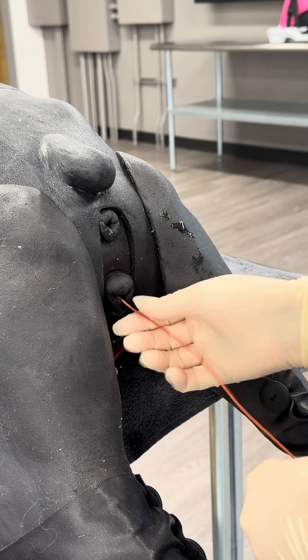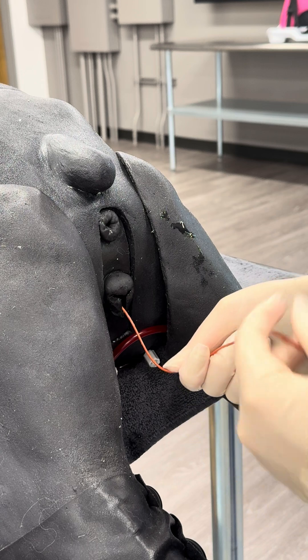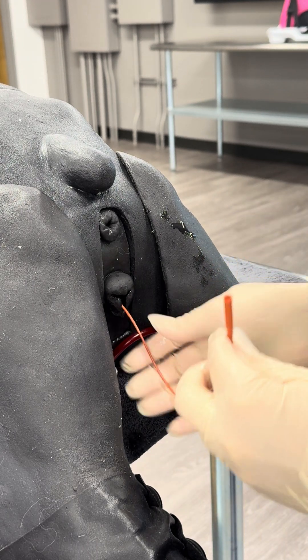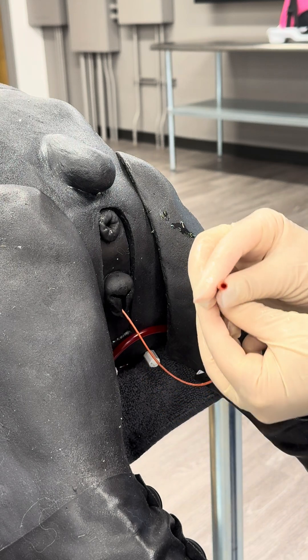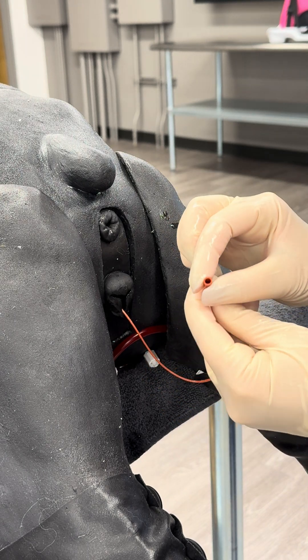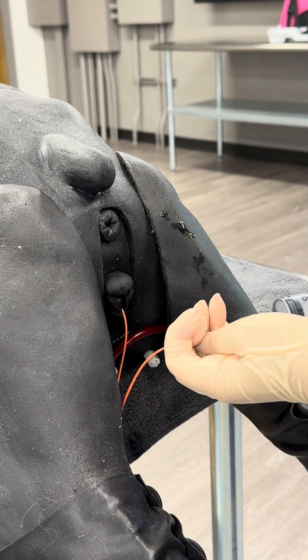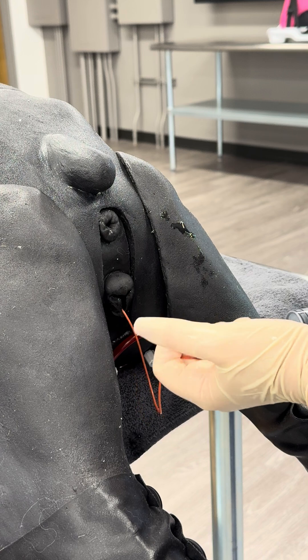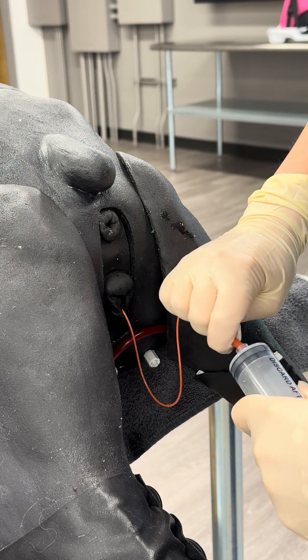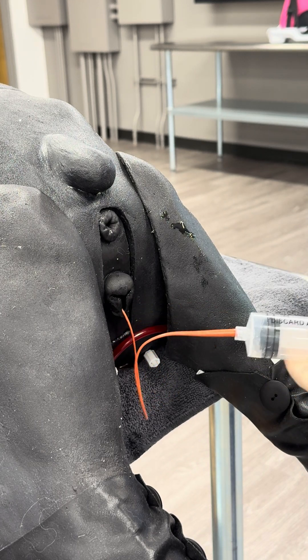I'm going to keep feeding gently until I get to my predetermined length, which I've measured hopefully before starting this process. Or if I start to get resistance or get urine flowing into the red rubber, then I know I'm in the bladder. I'm going to take my syringe and hook it up to the red rubber — it's a little difficult when you have lubricant on your fingers — and then I'm going to aspirate and I should get urine.